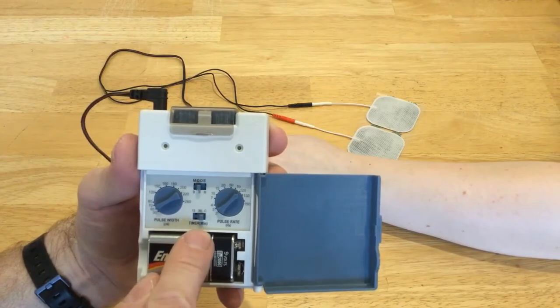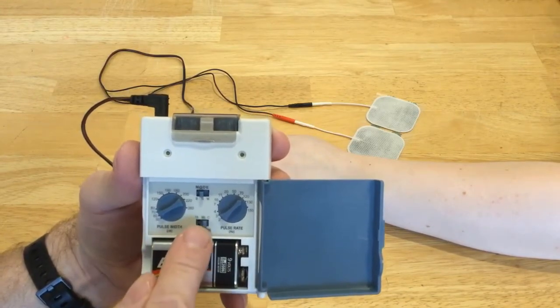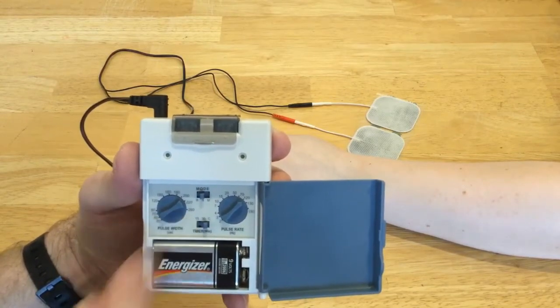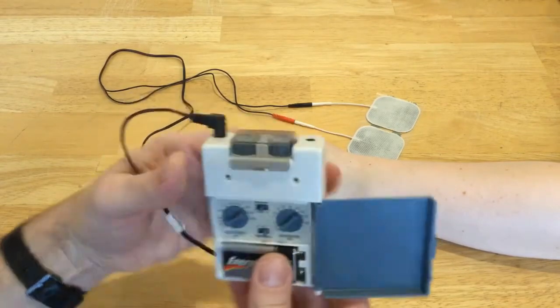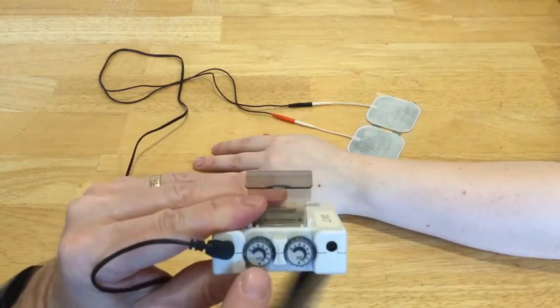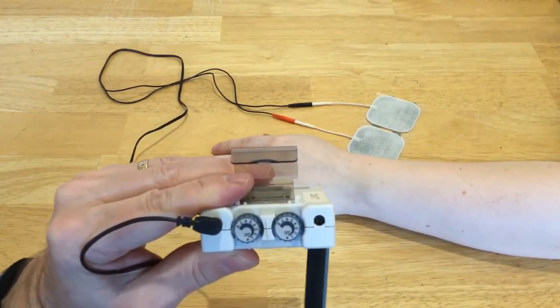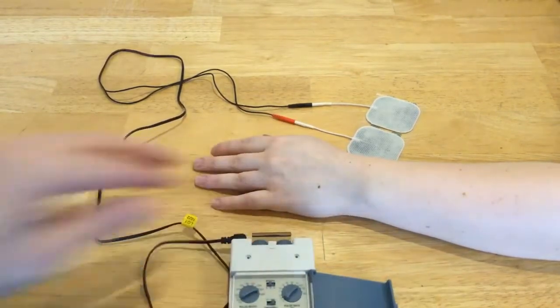As far as the timer goes, it's C for continuous, which is what I have it set at, or the 30 would shut off after 30 minutes, or the 15 would shut off after 15 minutes. On top is where you will actually turn it on and then increase the intensity using the dials there. So we're just going to try this a minute here.